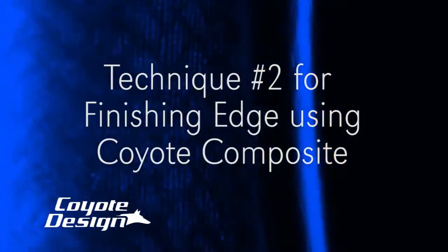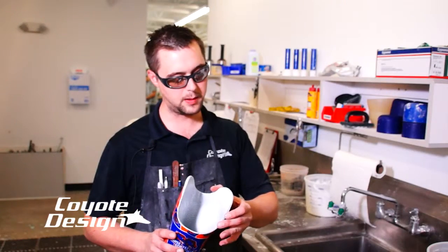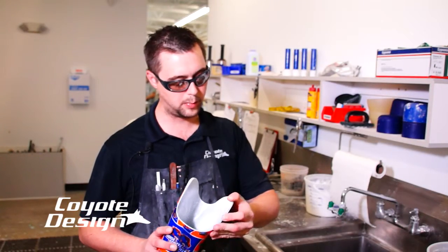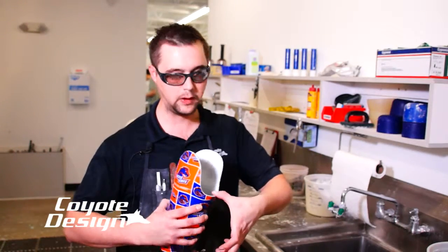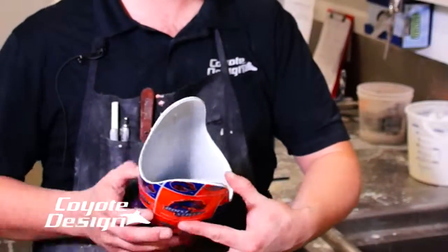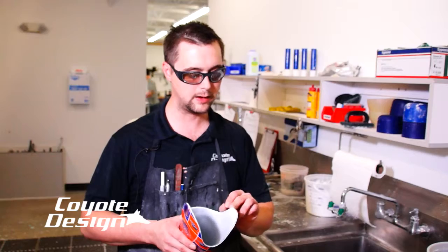We have one other little technique that Brad likes to use. One of the concerns with laminating coyote composites is the finished edge — but this will leave a nice smooth finish. Taking my hand now after buffing it out, I press on that and won't feel any of that composite inside of there. It actually finishes better than carbon sockets I've done in the past — those tend to stay really jagged.